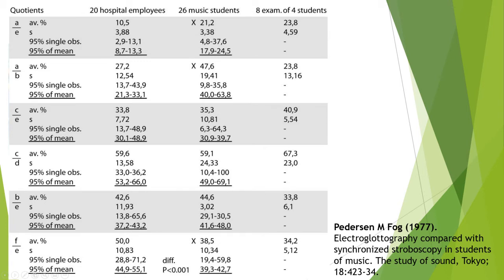The discussion about this is endless because the real difference probably lies in the amplitude of a much better function of the vocal fold muscles in the music students. Maybe this can be documented later on with tomography.